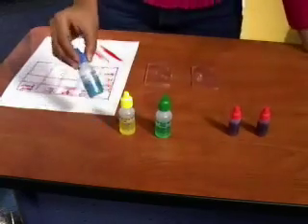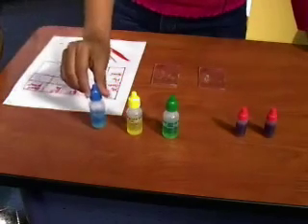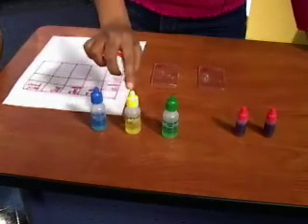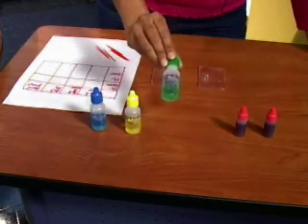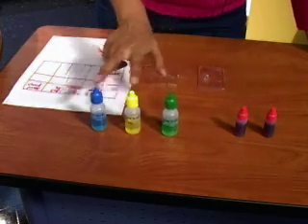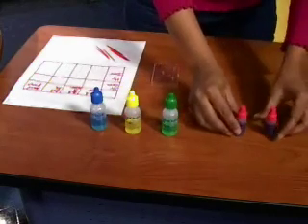So we have this synthetic serum, which is, this one is anti-A serum, which means it contains antibodies against the A antigen. This is anti-B serum, which means it contains antibodies against B antigen. And this is anti-RH serum, which means it contains antibodies against the RH antigen, which is antigen D. So these are the known substances. These two are unknown. Now we're going to mix the two together and then determine the blood group.